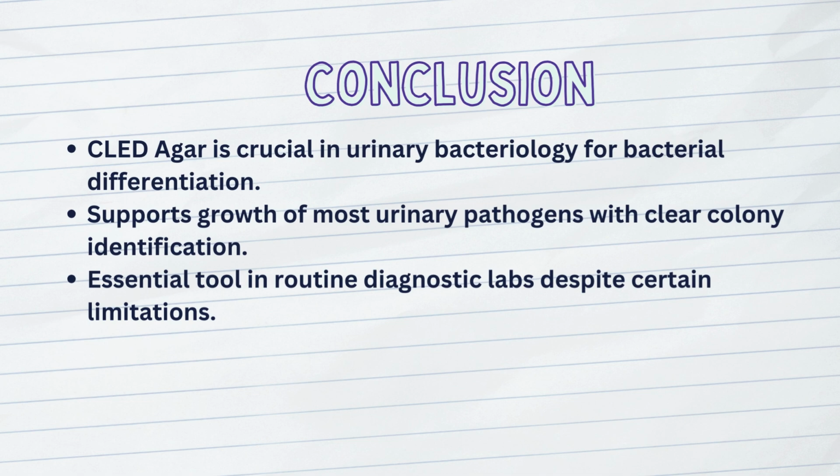So, to summarize it all, CLED Agar is a crucial medium in terms of urine analysis. It supports the growth of most urinary pathogens and helps us when it comes to identifying the bacteria. It's an essential tool in routine diagnostic labs despite certain limitations.